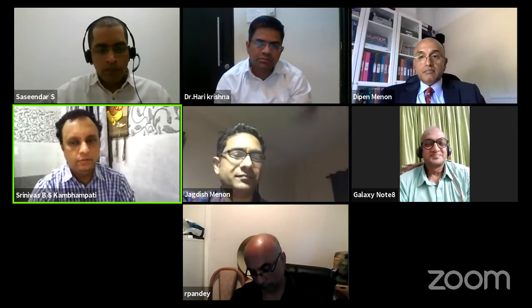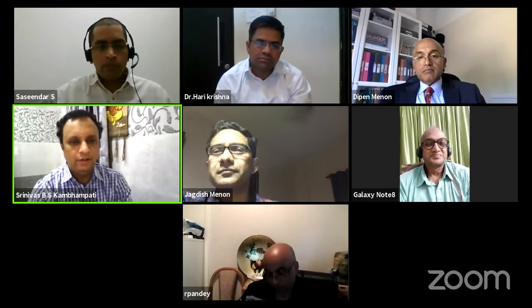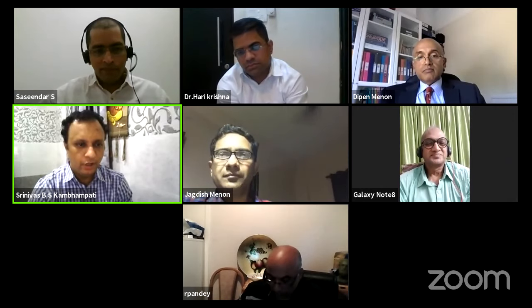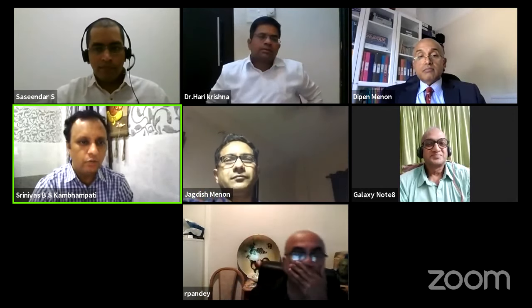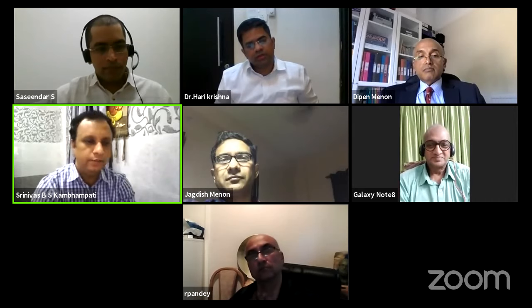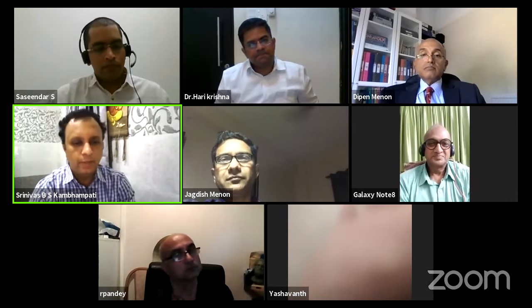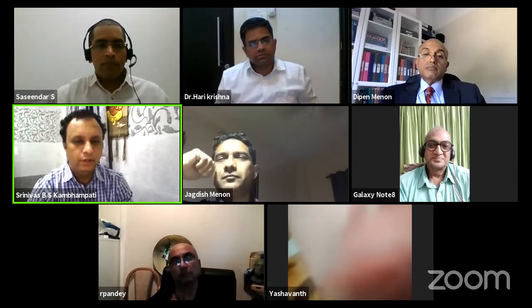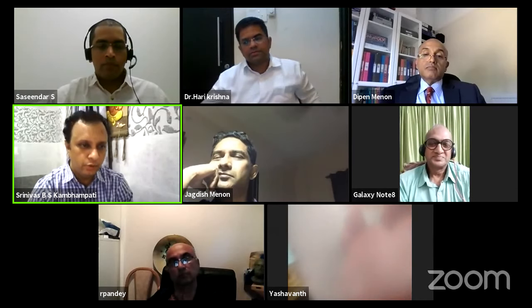I'm sorry, I just wanted to bring that up. I know a couple of tips for arthroscopy. For private practitioners, those who are starting new on arthroscopy, you should know about your equipment: your camera console, your shaver, the settings on the shaver, your light source, what the connections are, where they go, and how you record it. Because in the private setup, the people helping in the theaters may not know, or they might take leave, so you are alone managing the setup. You should familiarize yourself with it, how to operate it, and how to troubleshoot is very important.